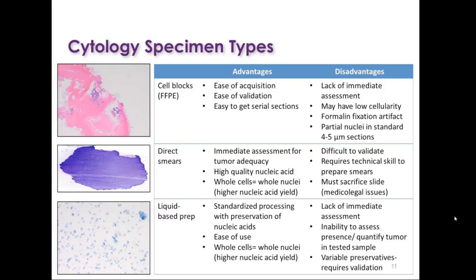The downside with using smears is that you do have to validate independently for any test that you're going to do. It requires some kind of skill and technique to prepare the smears, which may not be always available. And then lastly, when you use a smear for testing, you're going to sacrifice that smear. So there may be medical legal issues in terms of your archival slides and what you retain on file.